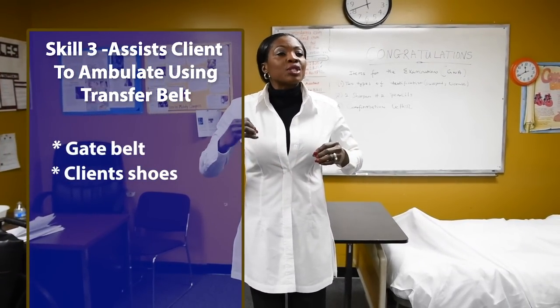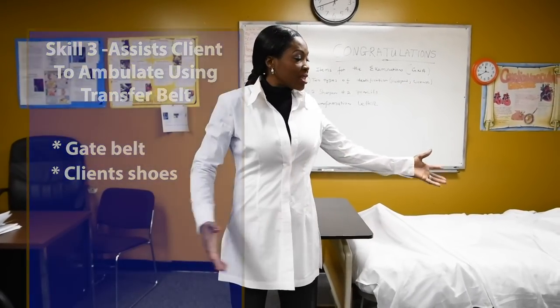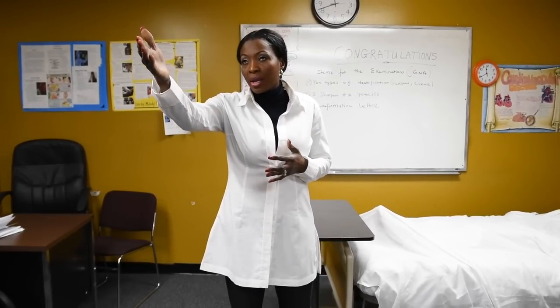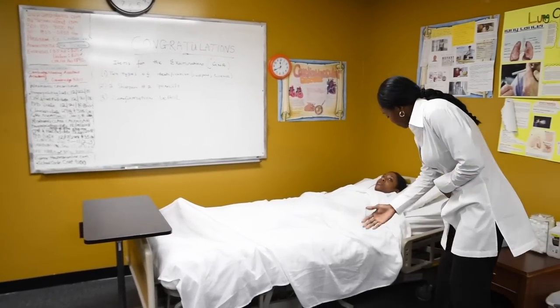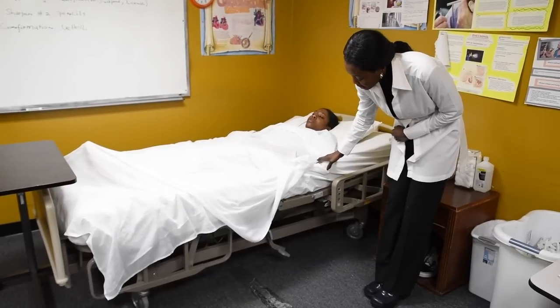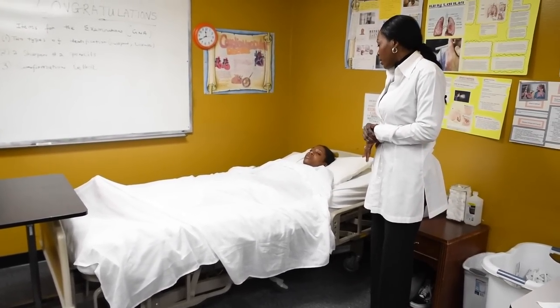The examiner is responsible for telling you how far to walk the patient. As far as this room is concerned, the examiner may ask you to walk your client or your patient all the way to this desk, but whatever they ask you to do, if they ask you to walk the client to their door, then that's what we would do, all right? So there you go. Tell the examiner, I've locked the bed to a safety position and I've brought my bed to a safe level, all right?